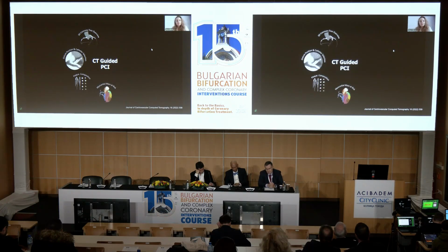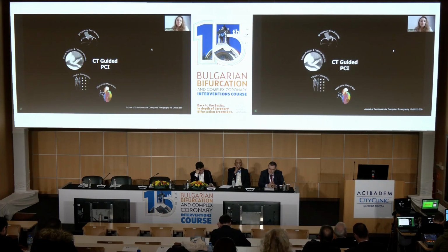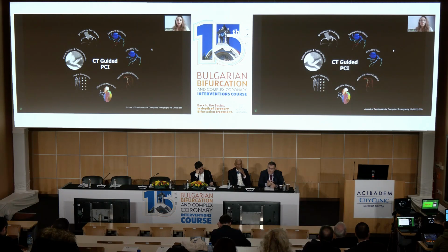Moreover, with special softwares not available everywhere, but probably it's coming, with CT we can evaluate the myocardial mass at risk, the mass that is supplied by the specific coronary lesion, so we can assess how large is the mass that is at risk. All of this we can use to guide our procedure, again with some specific softwares online inside the cath lab. And if FFR CT is available, we can also evaluate the functional significance of the coronary lesion.